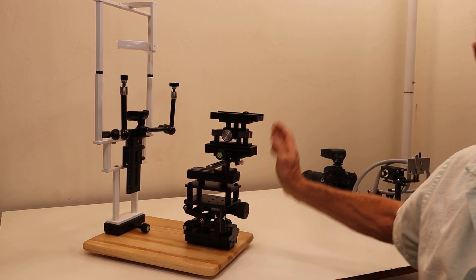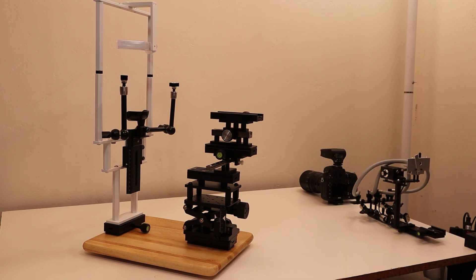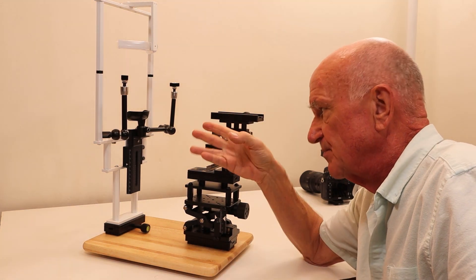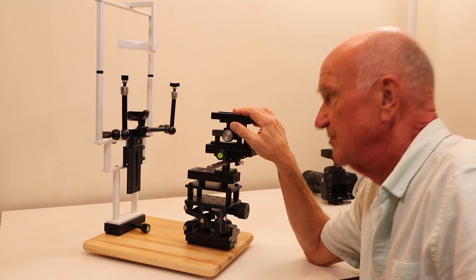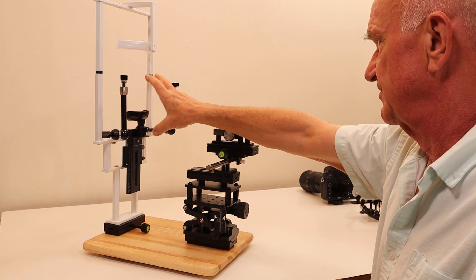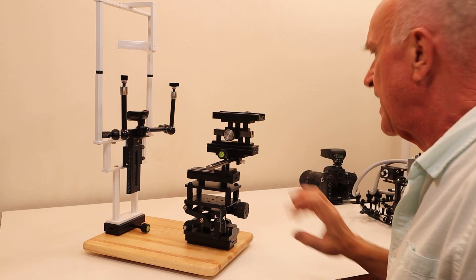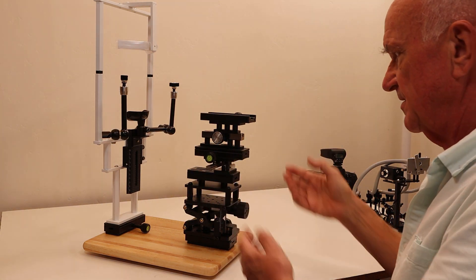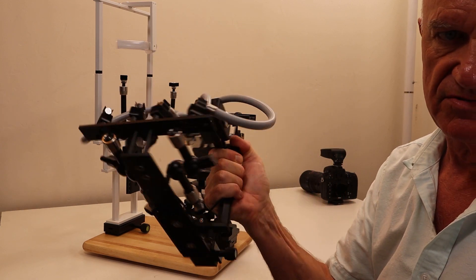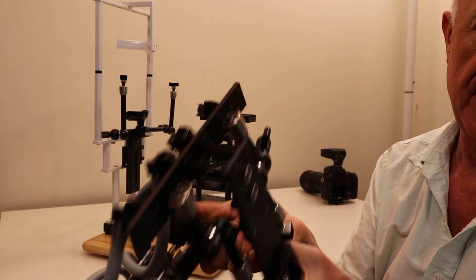This is the newest chin rest - I call it the Miles Eye Camera Support. It supports the camera, the eye camera, and it also holds the person's head stabilized to get good pictures. Normally this will be offered along with an illuminator, which is the newest style.